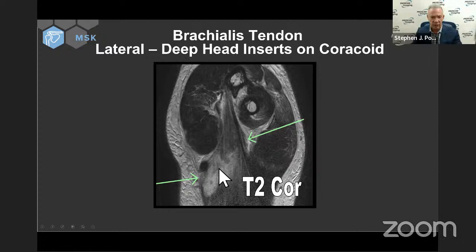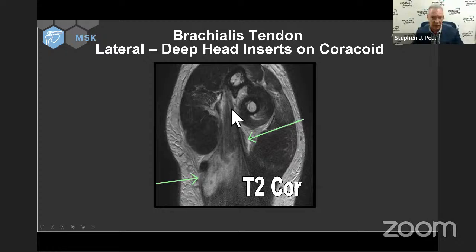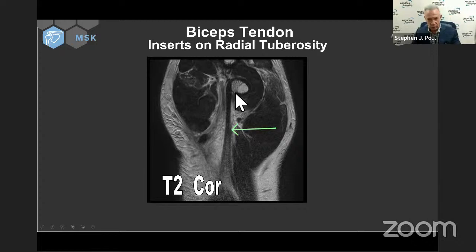Here's another one. This is a patient with a biceps injury. It's very easy to confuse the biceps with the brachialis. The brachialis goes to the ulna. The biceps goes to the radius. So you got to kind of tease them out. The radius is on the lateral side.